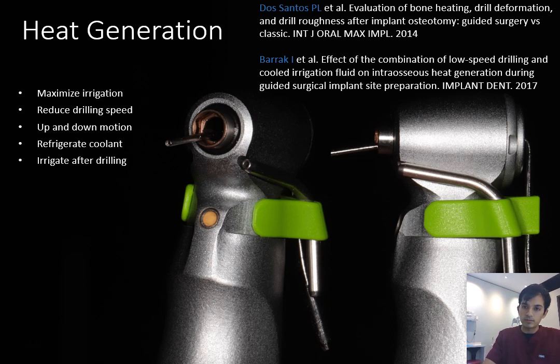I like to refrigerate my coolant, keeping it at roughly 5 degrees before we start the surgery, so that further helps to cool our drills. And just flush out your osteotomy with some saline in between drills to cool things down.